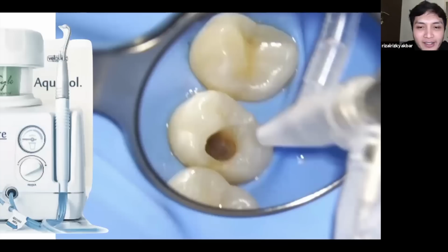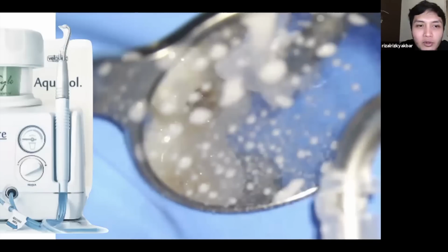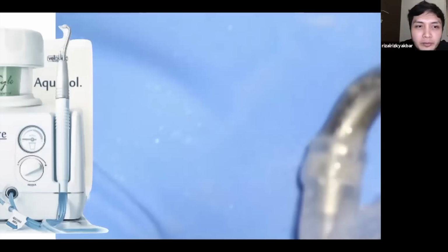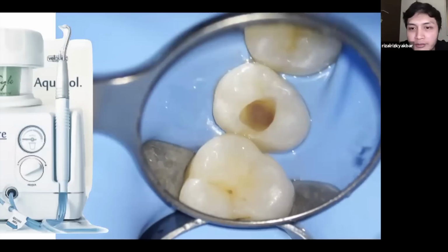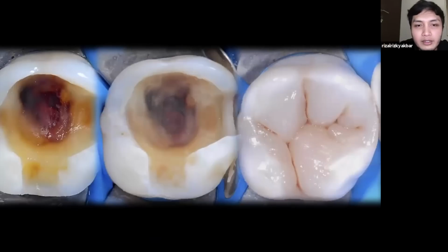Welcome. Okay, this is the example of the use of AquaCare. As you can see here, the cavity that you already think is clean is even cleaner if you use AquaCare. In this case, I use the blue powder. So I really recommend you to have that tool. In this case, the left one is before I use AquaCare, the middle one is after I use AquaCare, and the right is after the filling.